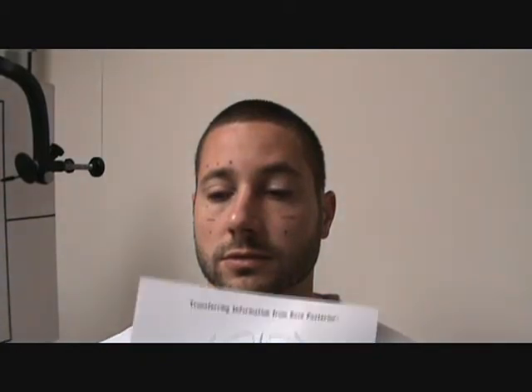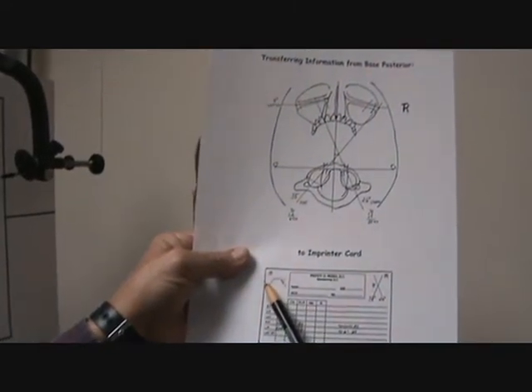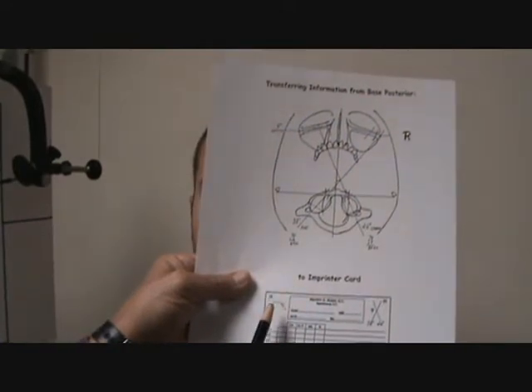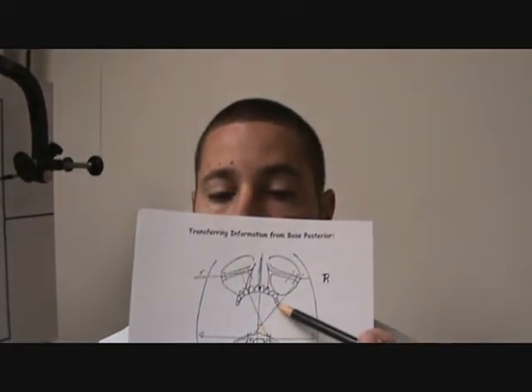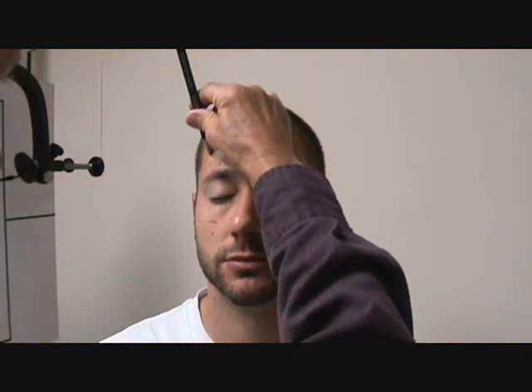As I'm looking at this orbit, I realize that when I'm transferring my points from the base posterior to the patient, the right side on the paper is not the right side of the patient. I've flipped this around so that this R represents the paper flipped, and those dots represent where the vertical collimator crosshairs go, depending on the respective orbit. In this particular case, the condyle line comes through the very lateral aspect of the orbit on the right side of the patient, so I'm just going to transfer that dot right above that orbit — that's where my vertical collimator crosshair will need to pass.